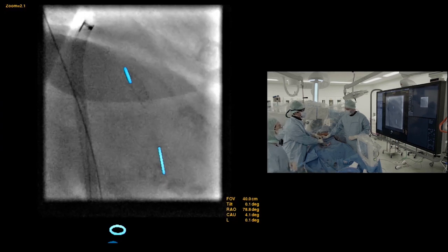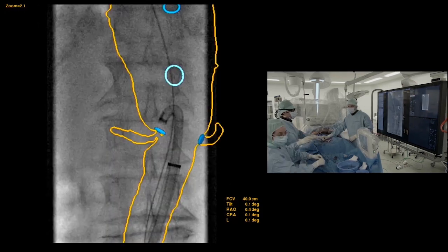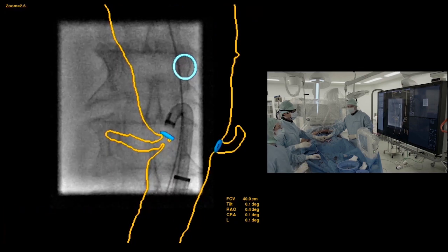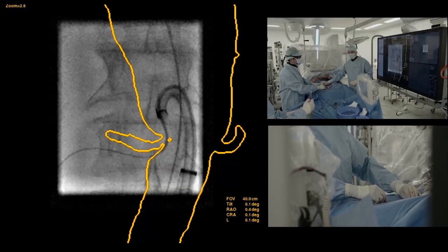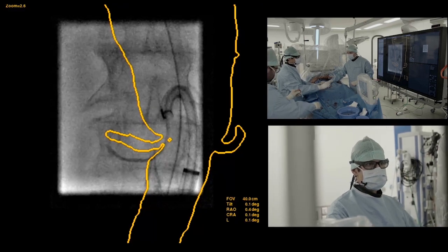and we're going to go down and try and access the left renals. Again, a collimation is performed on the fusion mask in order to really focus on the area of interest. And here Justine is slightly enlarging the image, and then to advance into the renal artery.